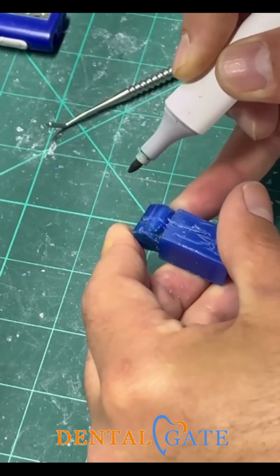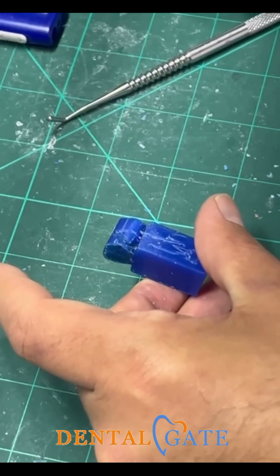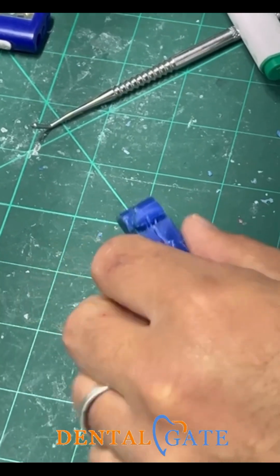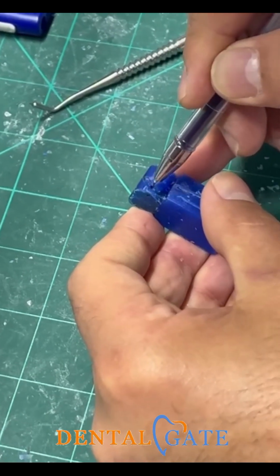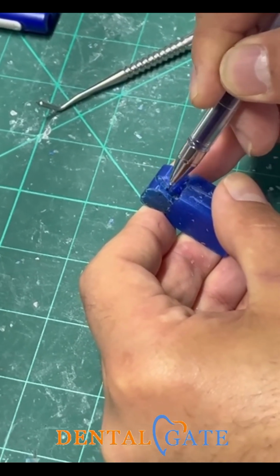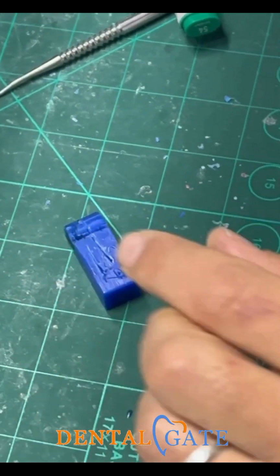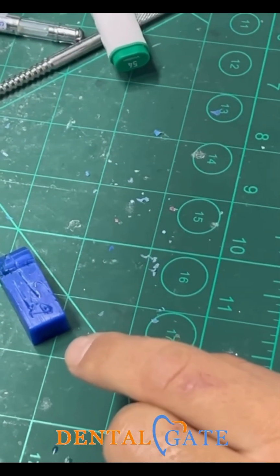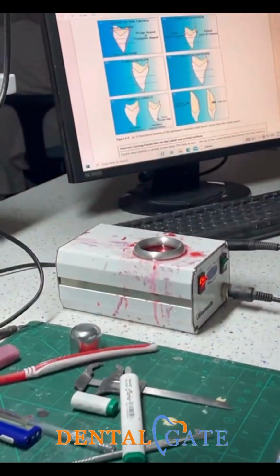And it will be changed to the tip of the block. So this is at the labial aspect. We finished that now. Now what I need is to make the lingual aspect.